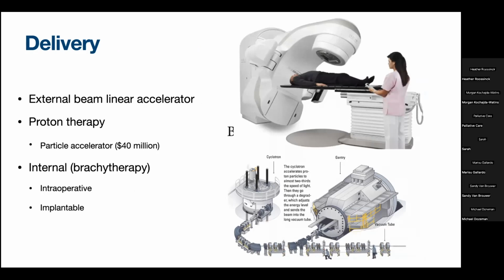Like I was mentioning, proton therapy with a particle accelerator, it is a very, very large machine. They have one in Beaumont on the east side of the state and had a price tag of $40 million. So I think that there are a handful of these around the country and a lot of exciting interest.